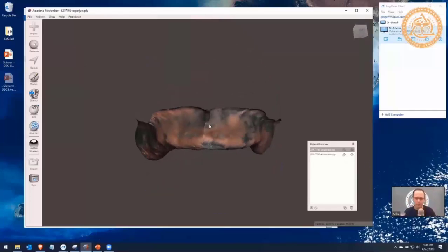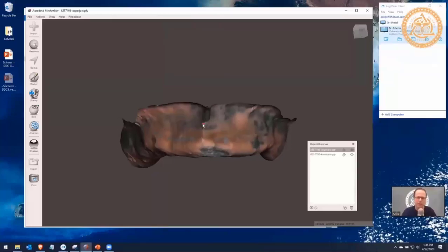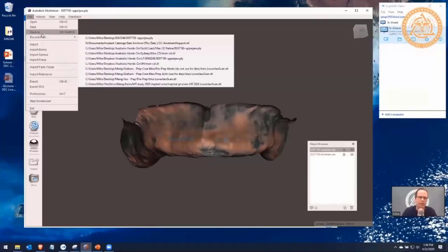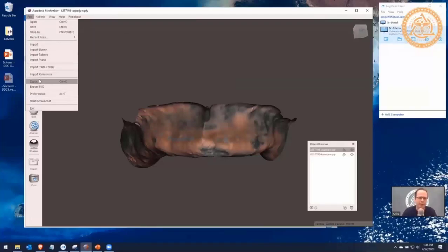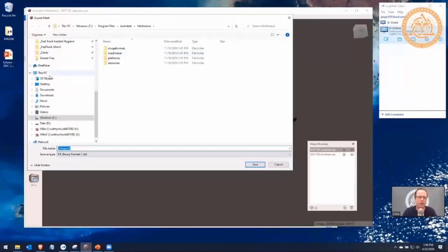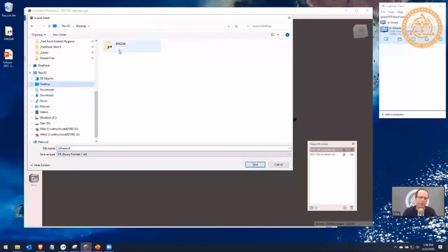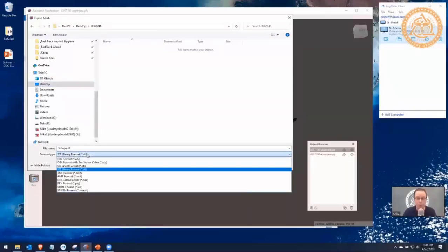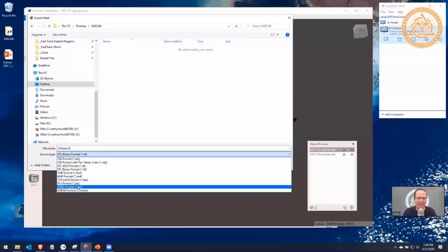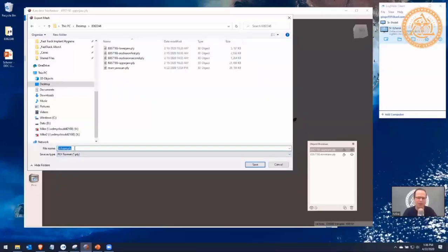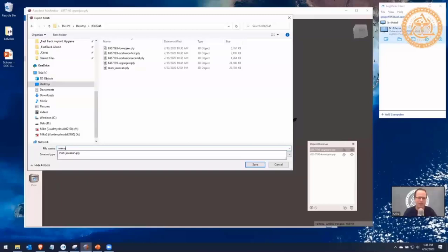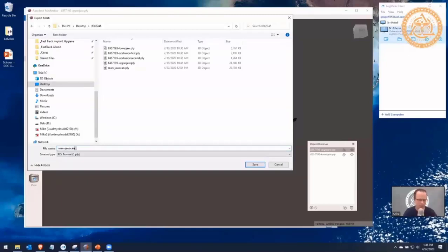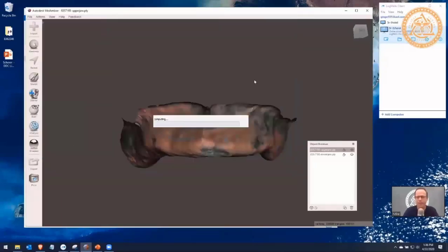Now, how do I take this file from MeshMixer and get it ready for ExoCAD? Go to File > Export — not File > Save As. I click on File > Export, navigate to the patient's folder, and save it. If you want color, save as PLY; otherwise save as STL. I'll call it manjawscan2.